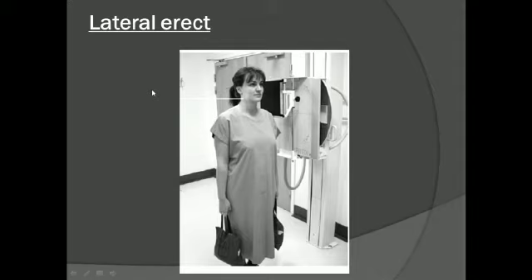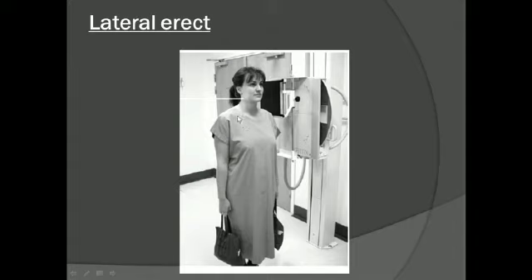We ask the patient to look straight and raise the chin a little bit, otherwise the angle of the mandible will be superimposed on the cervical vertebrae. We then ask the patient to hold some weight so that the shoulders come down a little, so that the thoracocervical junction becomes clear. Centering is one inch below the level of the angle of the mandible, on the cervical vertebra.